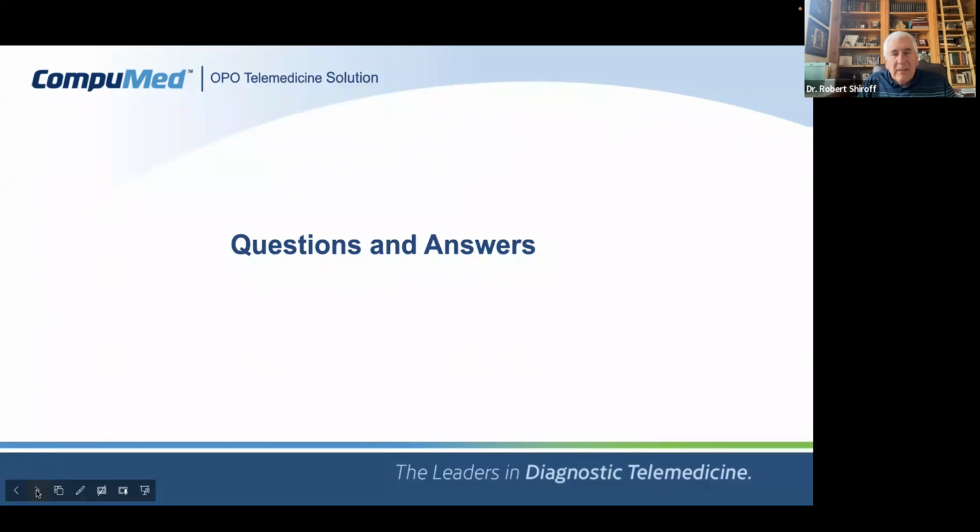To me, it makes sense to do it all if you have the time, because the information can be useful and can be helpful. And somebody may ask for it in terms of a transplant center saying, well, what were the pressures? What's the PA pressure? I need to know that. And then if you don't know it, then you're stuck either not getting the heart placed or having to go ahead and do another procedure on the patient.